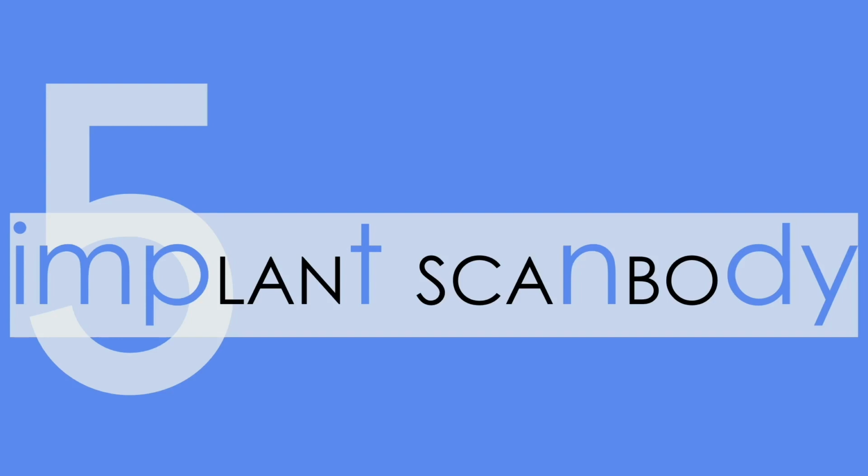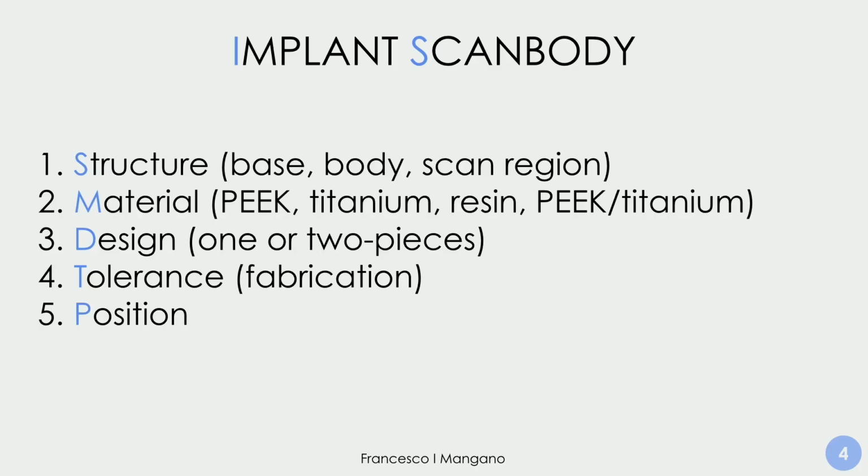I've read a lot in the literature recently, in particular the paper of Mizumoto and colleagues, a very beautiful paper. And I see that there are some factors that we need to consider when we talk about implant scan bodies. First, the structure. The scan bodies are divided into three parts. Basically, we have a base, that is the mating part with the implant or the implant analog. Then we have the body. The body is usually a cylinder, and then the scan region, that is usually a flat surface or an intaglio, a slide on the top of the body.